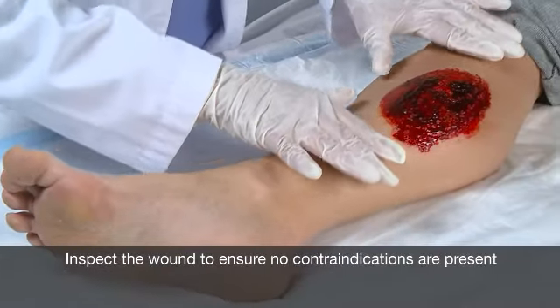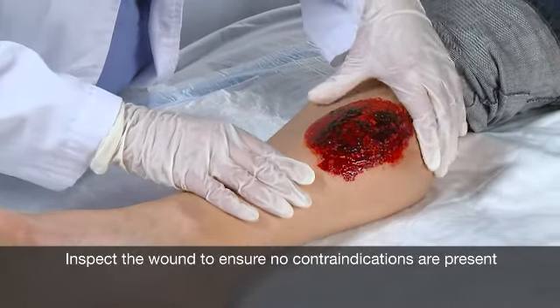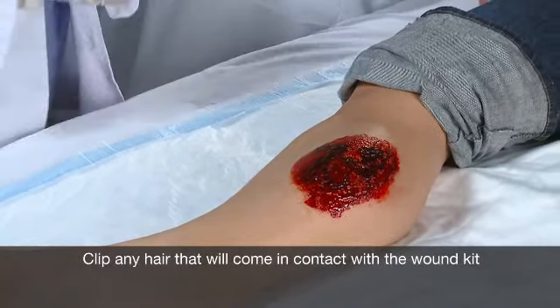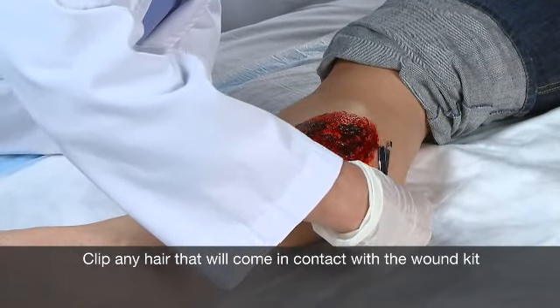Begin by carefully inspecting the wound to make sure there are no contraindications present. If you find a contraindication, you should select a different treatment for the patient's wound. Next, clip any hair that may come in contact with the wound kit for a better seal and patient comfort.